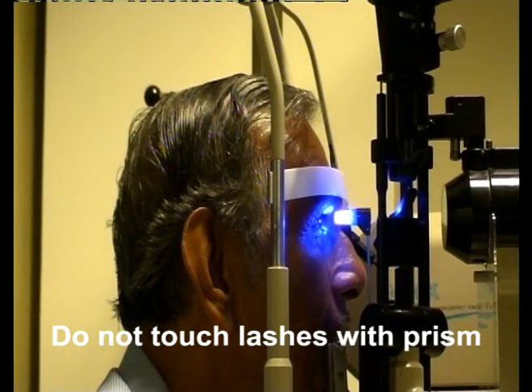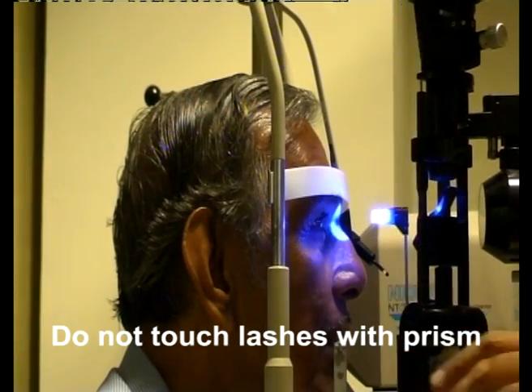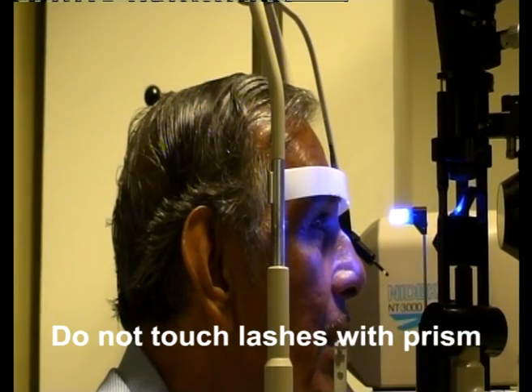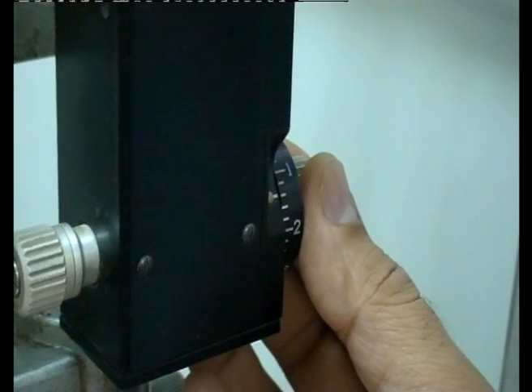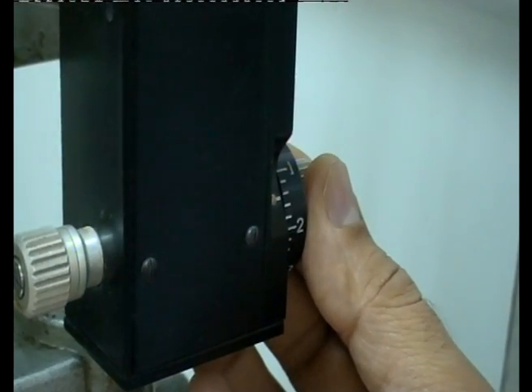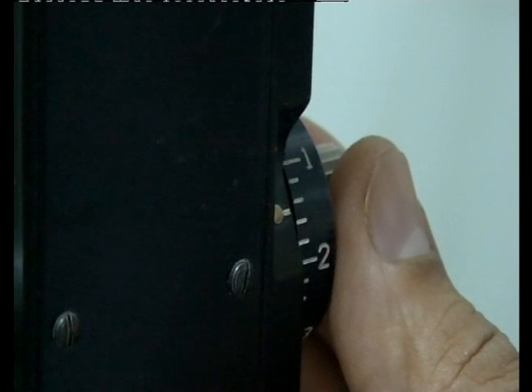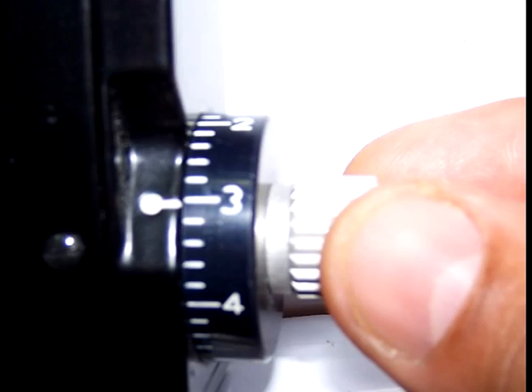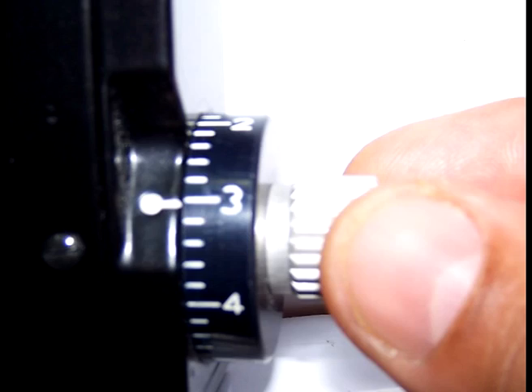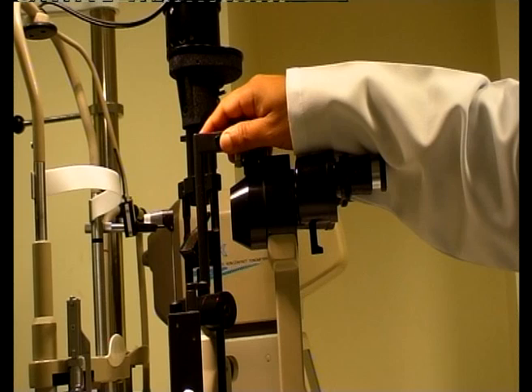Do not touch the lashes with the prism — they are not anesthetized and will induce blinking. It is more accurate to measure increasing than decreasing intraocular pressure, so keep the drum position lower than the expected value of intraocular pressure. Although you can start with a higher drum reading than 1 if intraocular pressure is expected to be very high. The prism and tonometer should get fixed in the notch.